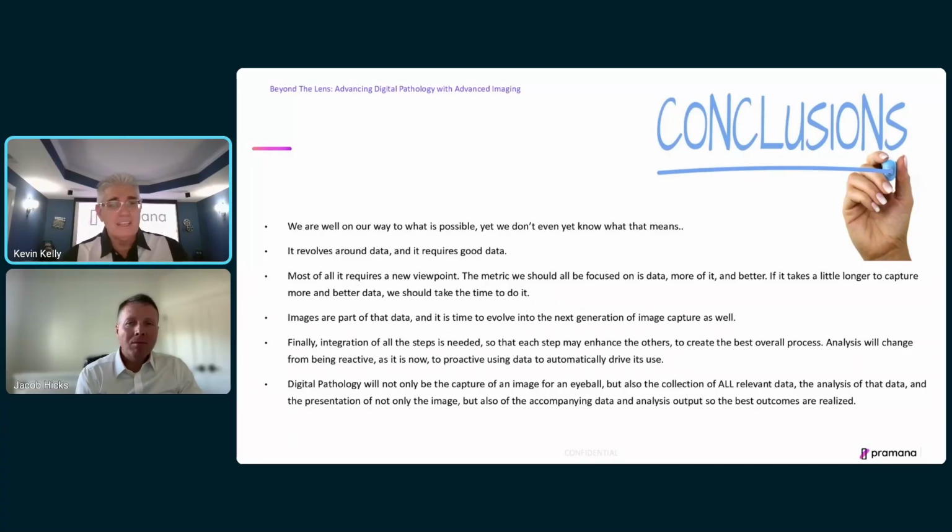Now, the problem is fluorescence takes a lot of time. It's a very manual setup. So up till now, there are no high throughput or accelerated time fluorescent scanners with Z-scan capability. There are plenty with Z-stack capability. They're just a very manual process, and it takes time. But yes, it's very important to it, and volumetric imaging will apply greatly to it. But right now, I don't know of anyone out there that's truly embracing accelerated volumetric imaging in the fluorescence space.